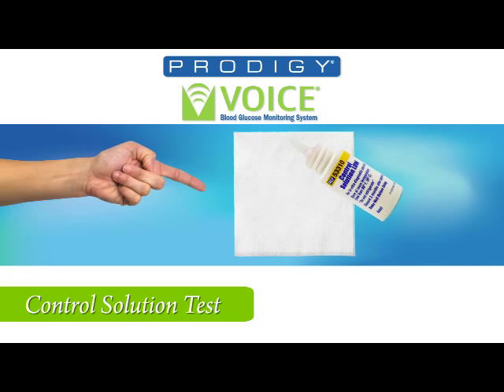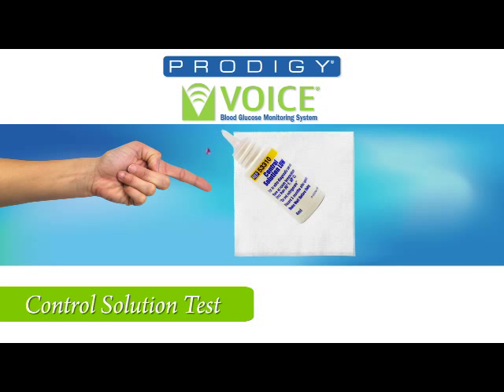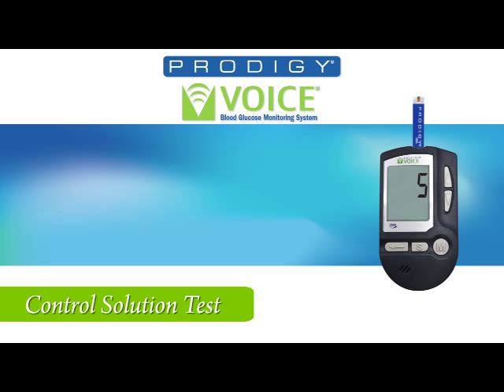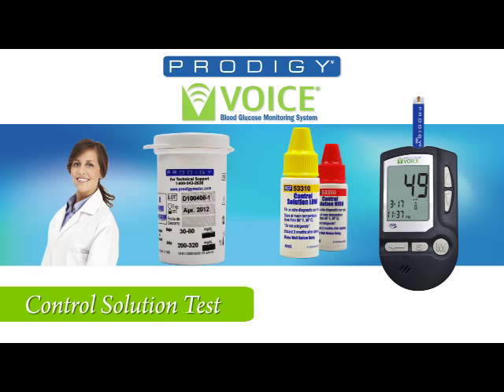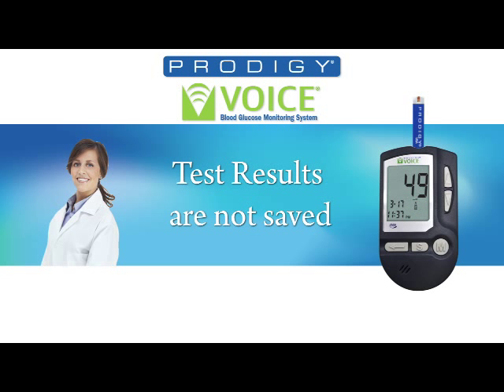Now shake the bottle and discard the first drop on your tissue. The second drop is applied to your finger and then applied to the test strip. When the opening is full, you will hear a beep and then 'Now testing.' The meter will count down and report the test results: 'Your blood glucose, 49 milligrams per deciliter.' Now you can check the solution ranges on your test strip vial. Remember, in the control solution mode, the results are not saved.